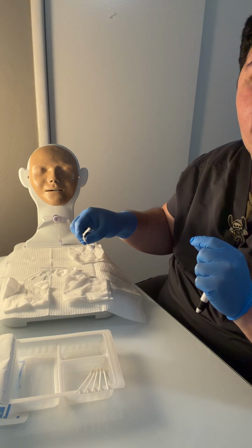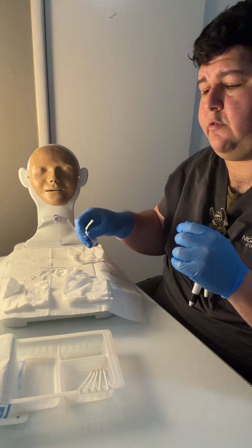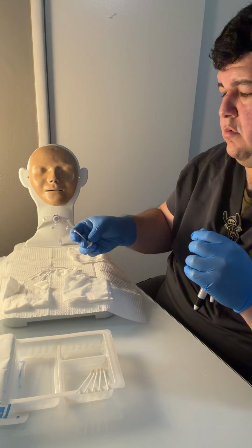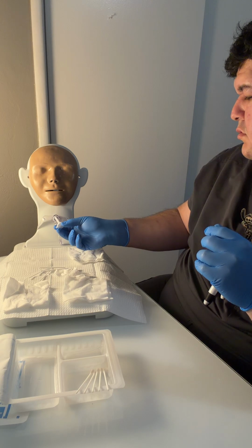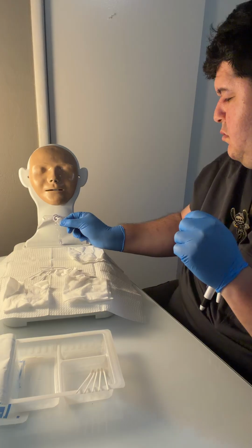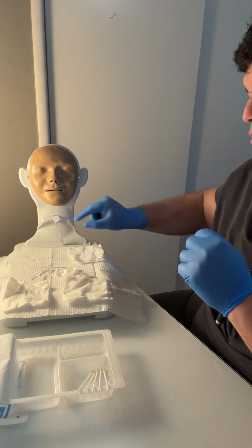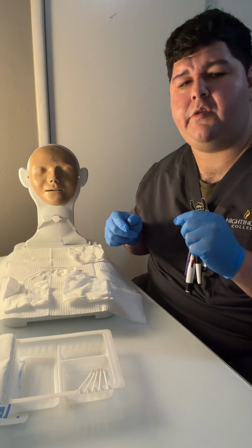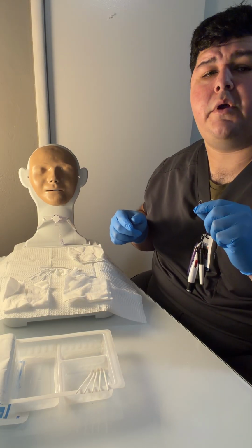Once it's dry, I will then go ahead and replace the inner cannula using the curvature and secure it back into place. Okay, then we're going to be taking our Q-tips that have been soaking in the normal saline and clean around the stoma.